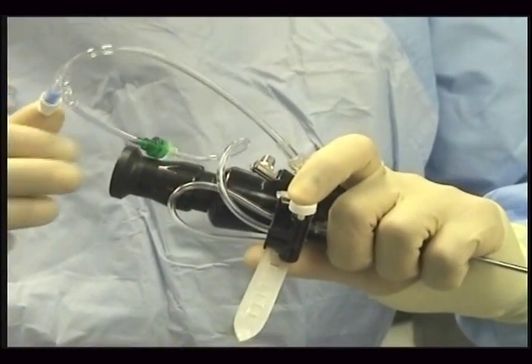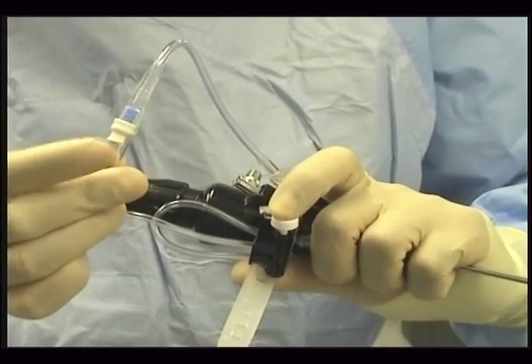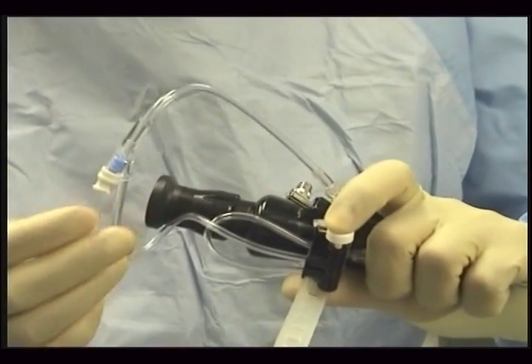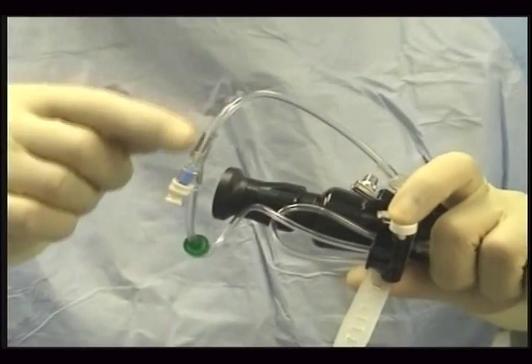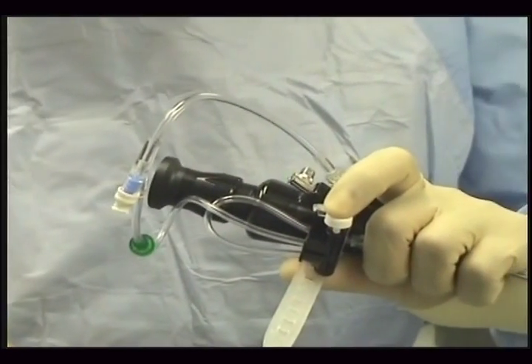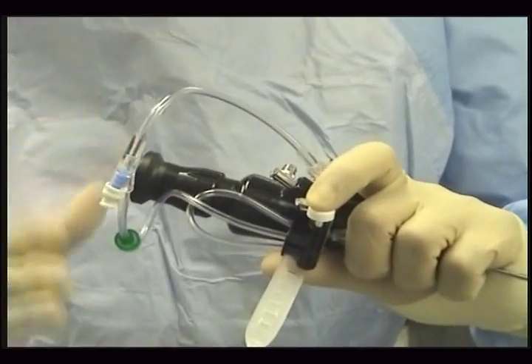Anytime you want to inject contrast, you will use this port to inject contrast. This is a check valve to prevent the contrast coming back into the valve body. One-hand operation.